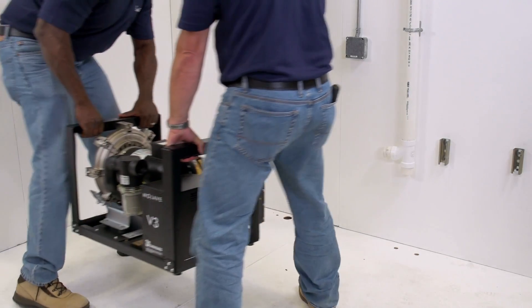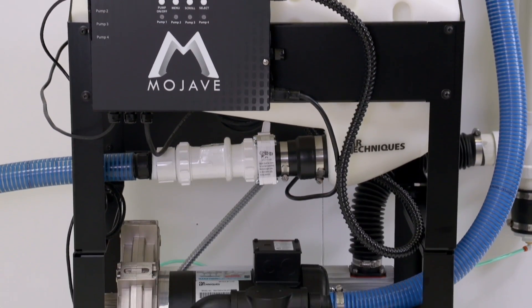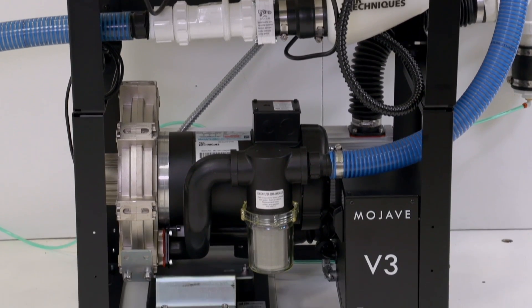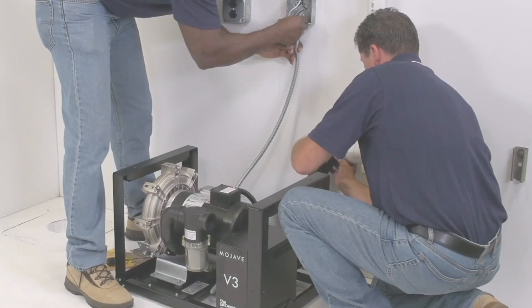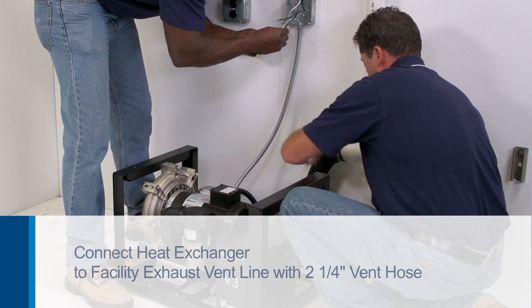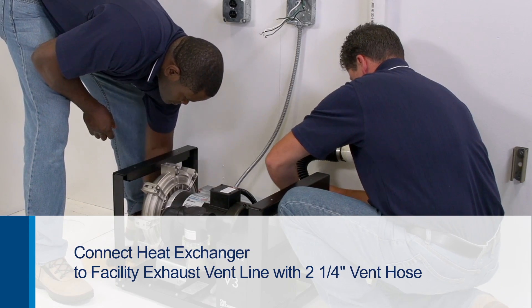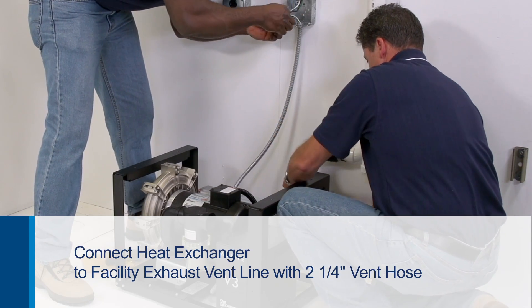Place the pump in the chosen location. Each pump assembly comes with the hardware necessary to stack another pump or stack a single tank with the pump. Start by using the 2¼-inch vent hose and connect the heat exchanger to the facility's exhaust vent line. The vent hose is provided in the pump accessory pack along with the hose clamps.